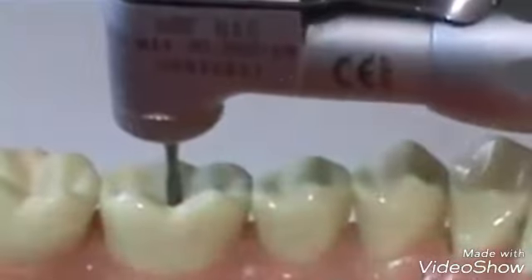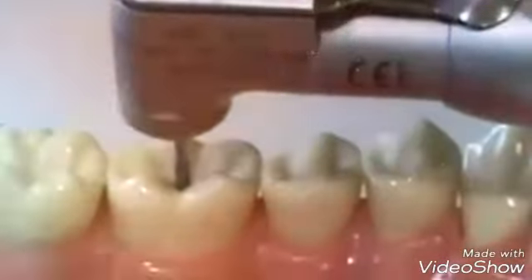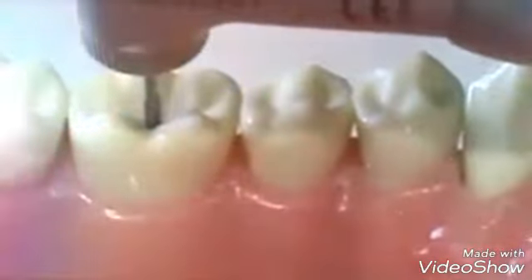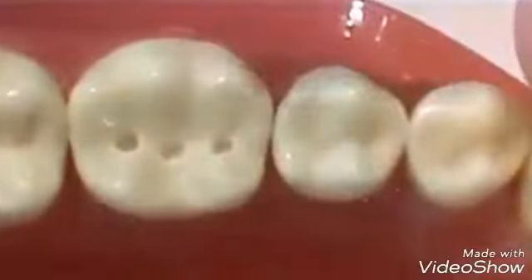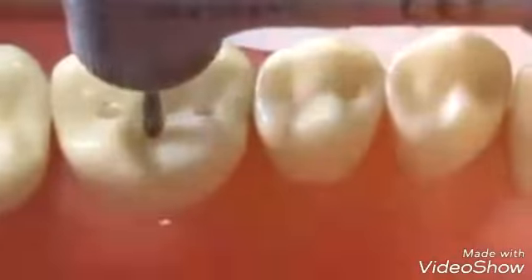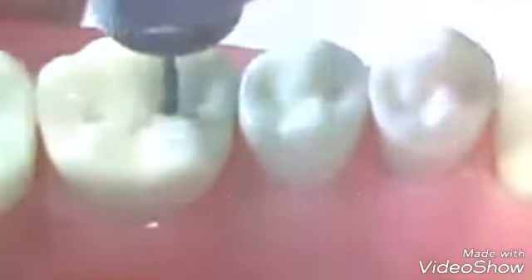Notice that the fissure bur should be placed on the floor of the depth of the hole to make a uniform depth of 1.5 to 2 mm for all the cavity.